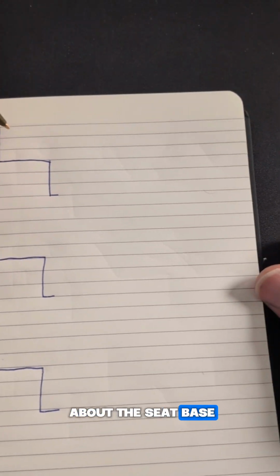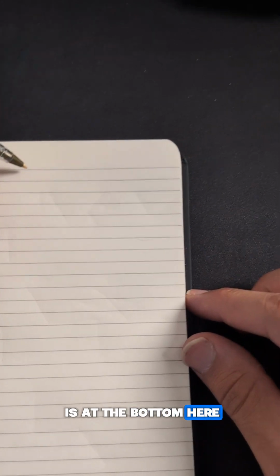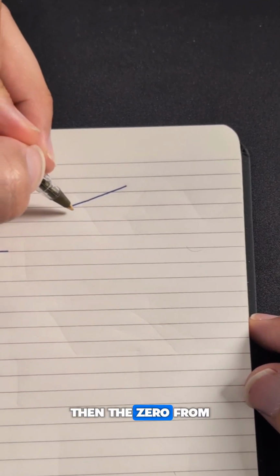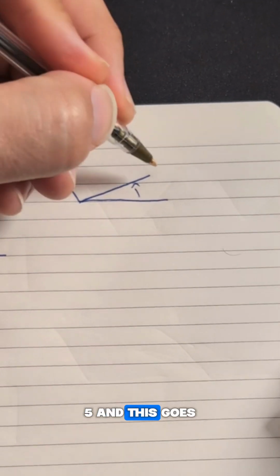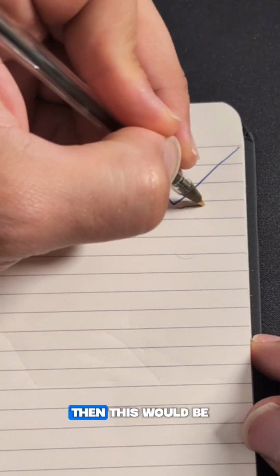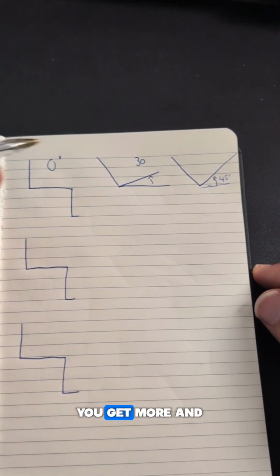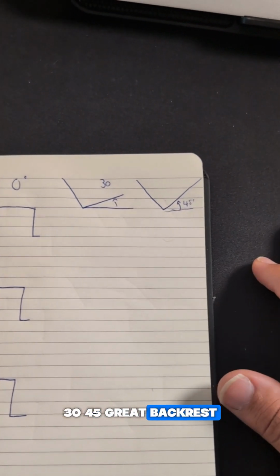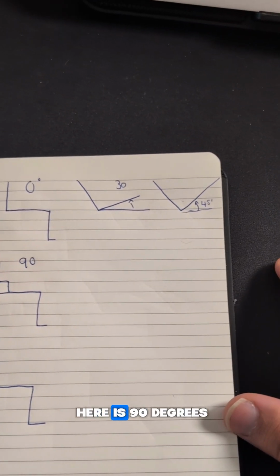When we're talking about the seat base, this is what's considered 0 degrees, meaning that the seat base is at the bottom here. As we go into, say, a little bit of tilt like this, then the 0 from here comes up as we go up. So we go 1, 2, 3, 4, 5, and this goes up to say about 30 degrees. If someone's in all the way amount of tilt, then this would be like 45 degrees. So it goes from 0, as you go up, you get more and more tilt from there. 0, 30, 45.